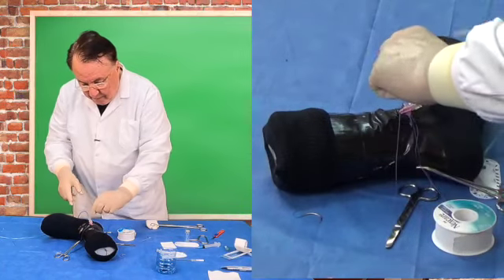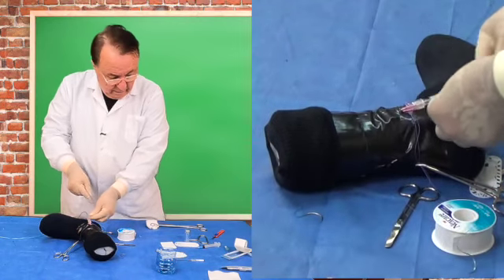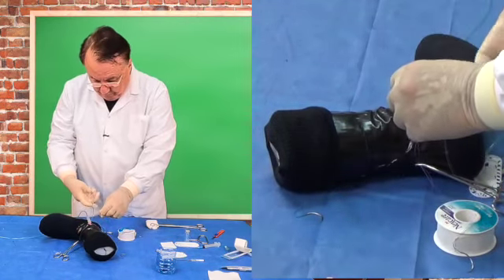Now, I have the catheter secured in place.